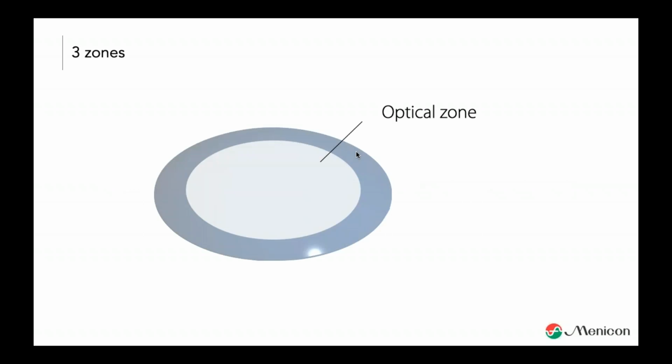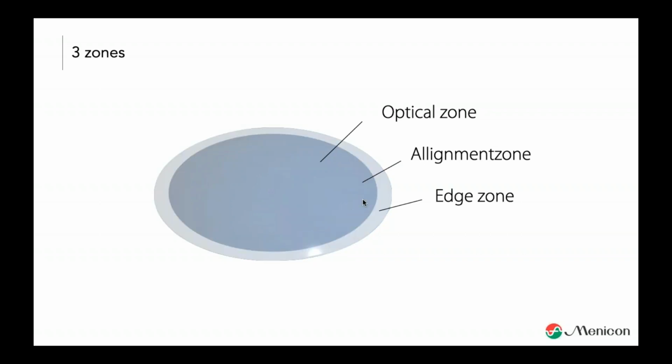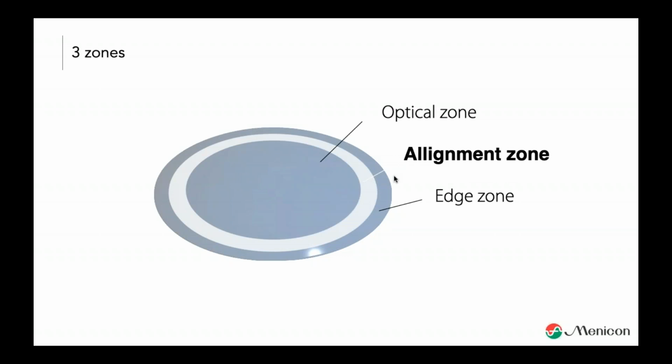So that being said, a bit more explanation of what I mean by a different approach to lens fitting, another fitting philosophy. Well, we have to look at the design of a contact lens, and if we see a normal contact lens, in the center area we have an optical zone, and then we have an alignment zone, and at the end we have an edge zone. That's in a rough vision. That's how the design of a lens looks. But the fact is that the alignment zone, in every contact lens, is the place where the lens actually hits the cornea, what we call the point of touch. This is the area that will fit on the cornea.